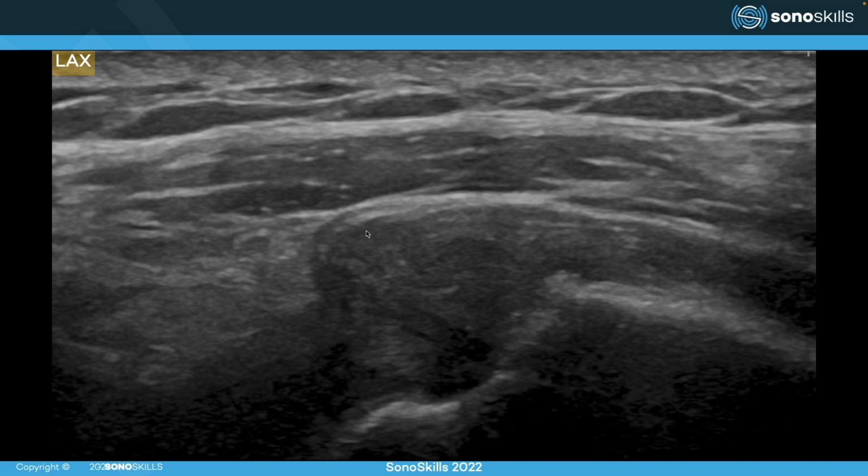This is an example of the supraspinatus more anteriorly. Like I mentioned, this is a highly relevant spot underneath the coracoacromial ligament. This is the transverse ligament. This patient is making an abduction, and we can see that the supraspinatus is being squeezed underneath the ligament right there. And yeah, this is an impingement at coracoacromial ligament level.